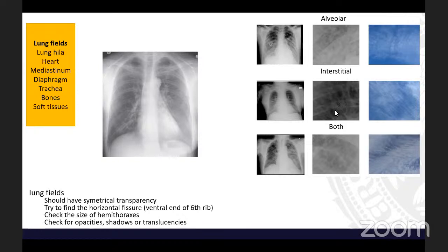Also, this distinction was important when there was no HRCT. When we have HRCT, we can tell a lot of things about lung parenchyma and what's going on there, which can be for a lot of other lectures. So we usually just say that there are opacities, and sometimes it's hard to distinguish interstitial. If you have interstitial processes, this is usually in cardiac edema, for example. It's nicely seen that you have a lot of lines there, but trust me, you need a lot of experience to distinguish these things. We can talk about it later, but I don't want to get mixed much into this now. So, those lung fields, we'll work with that.